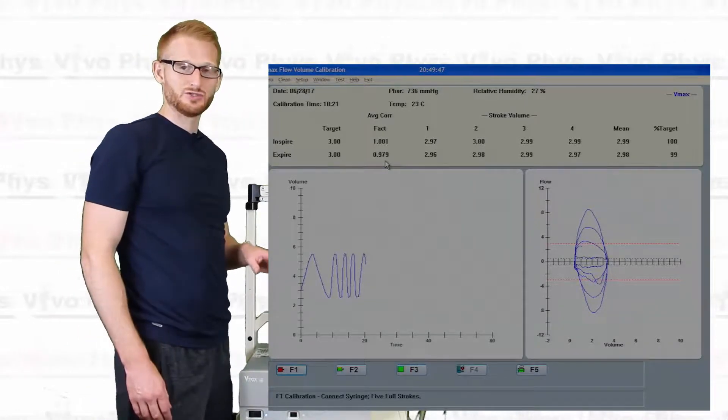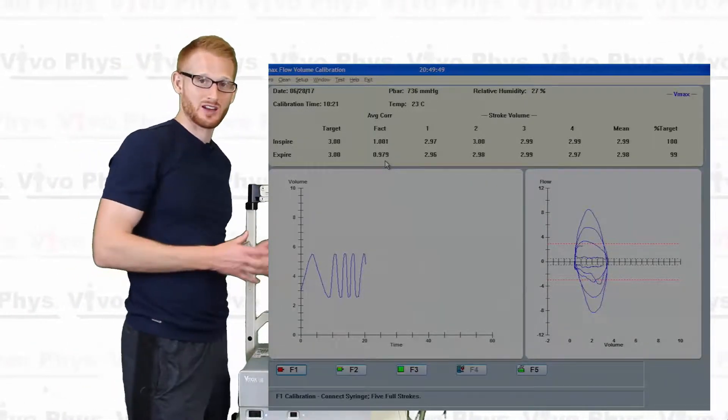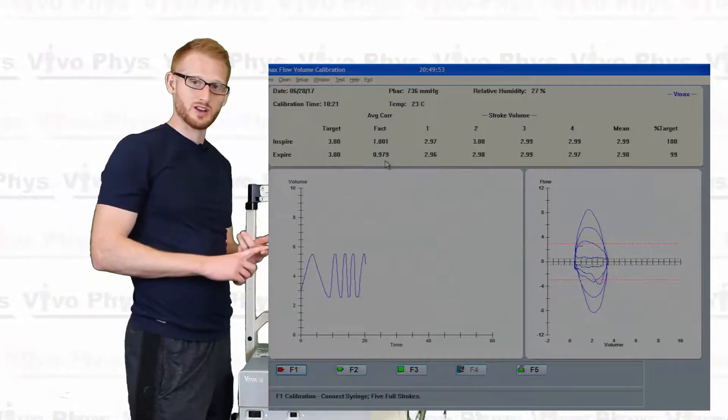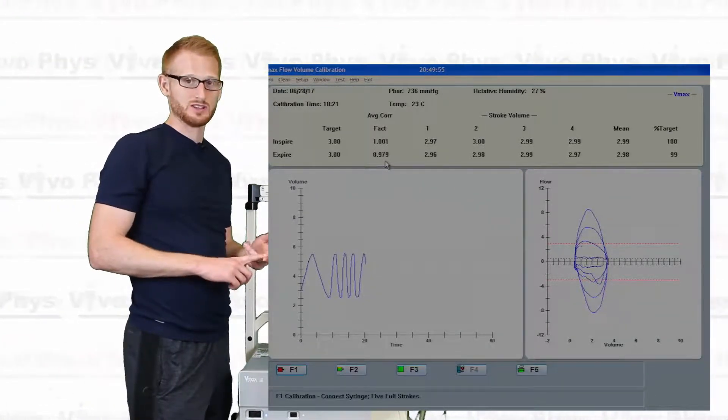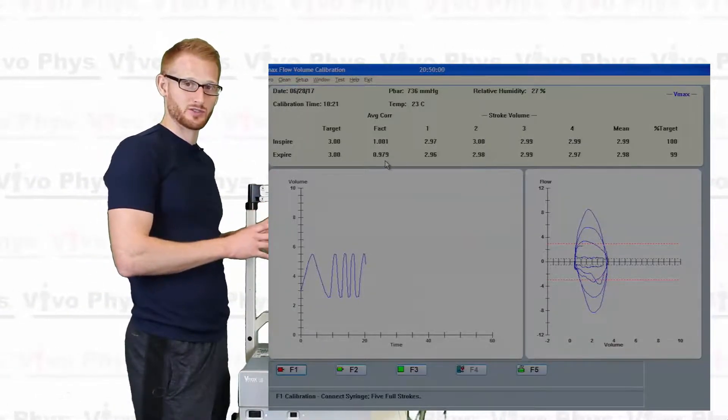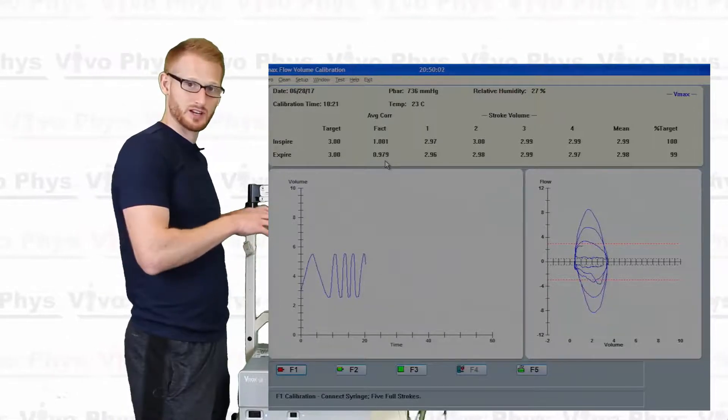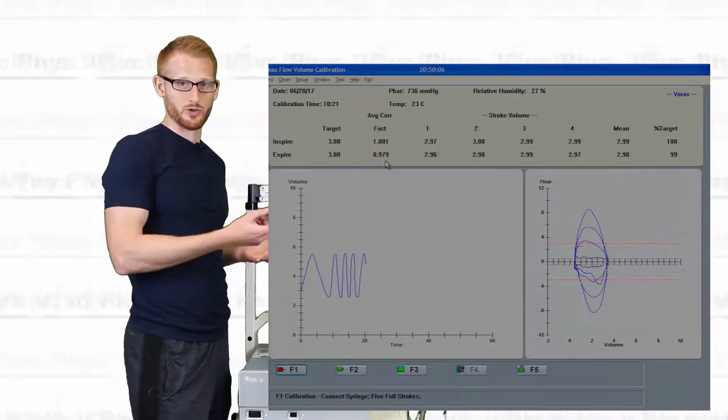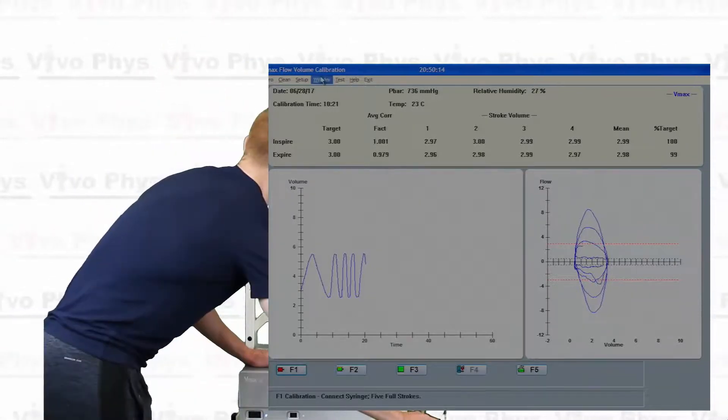Before we can actually do the flow calibration, we need to tell the system what the ambient room is like. So we need to tell it humidity, we need to tell it the temperature, and we need to tell it the barometric pressure. Alright, so the reason why we're doing the flow calibration first is because in this particular system, the flow calibration is where you have controls over those three. We're going to click on setup.